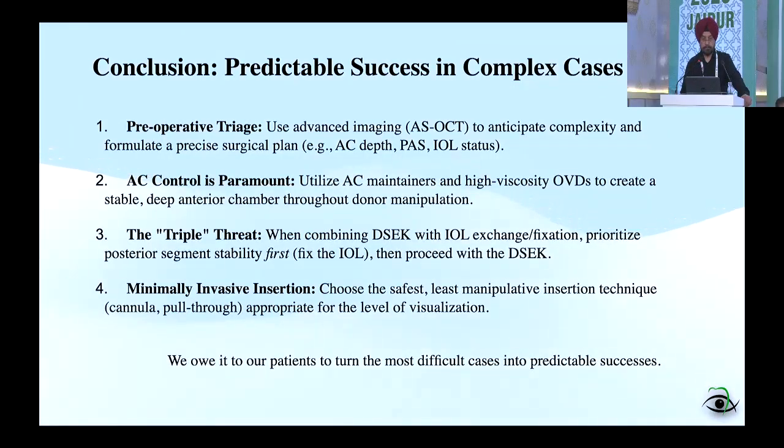So conclusion: predictable success in complex cases, preoperative ASOCT and the proper management of the anterior chamber, analysis during the slit lamp. AC control is of paramount importance, like utilizing an AC maintainer, high viscosity OVD to create a stable deep anterior chamber throughout donor manipulations.